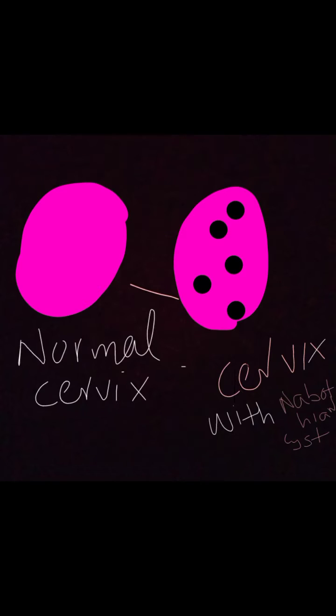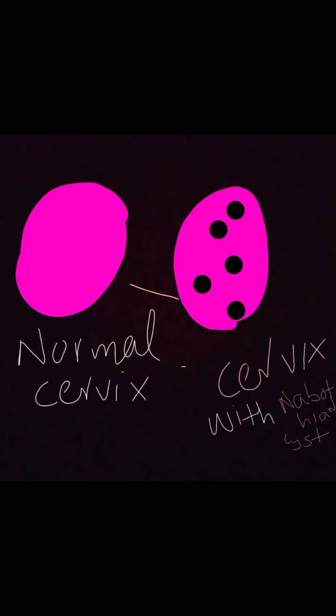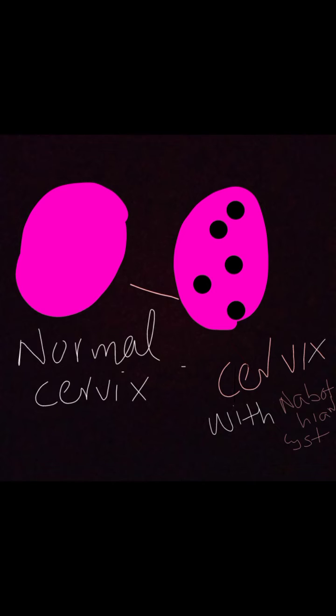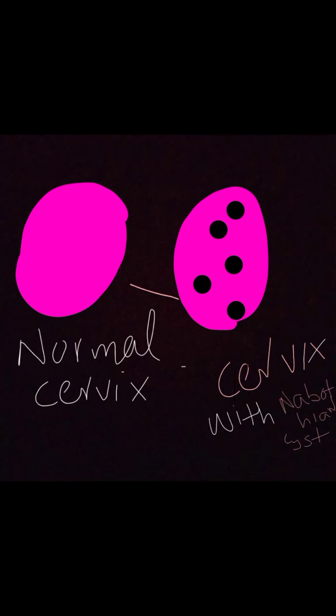Nabothian cysts are lumps or masses filled with mucus or clear fluid in the cervix or lower uterus. They are caused by the blockage of Nabothian glands. Lower abdomen pain and pain during intercourse are the main symptoms. This is a normal cervix, and this is the cervix with Nabothian cysts. Thank you.